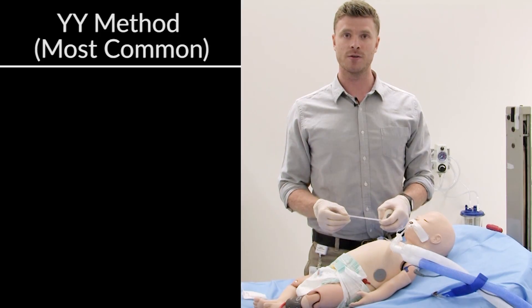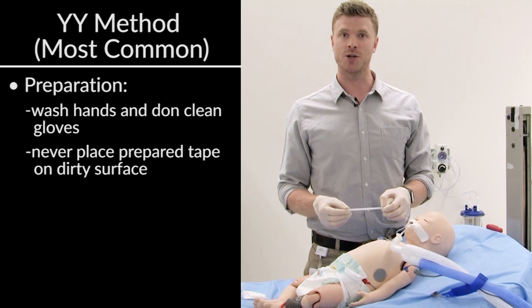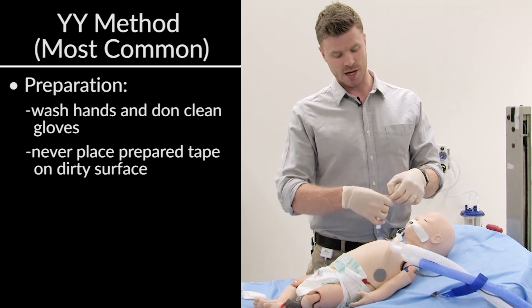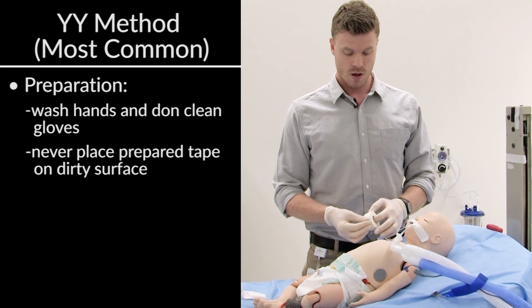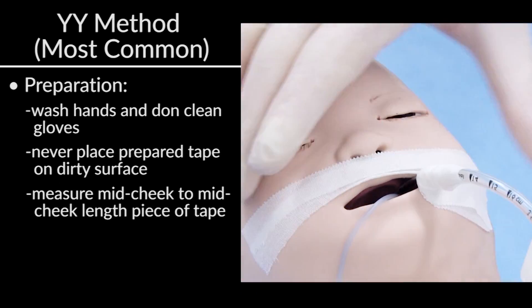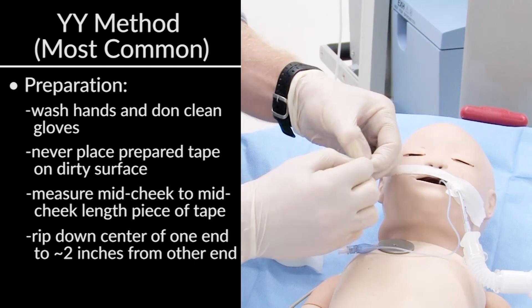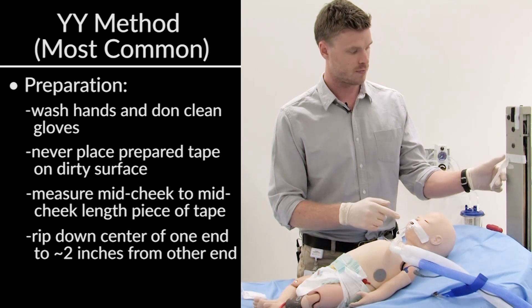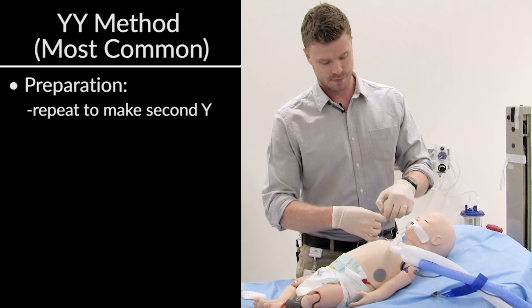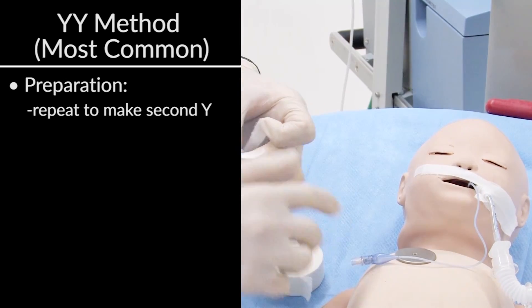I'm going to review the first oral method, which we refer to as the YY tape job. Always make sure that you use standard precautions — that is hand washing and gloves — and never put the tape on the face on a dirty surface. I'm going to put one piece of tape on the surface and stick my prepared tape on it so it doesn't touch a dirty surface before it touches the patient. You're going to want to measure out a piece of tape approximately mid-cheek to mid-cheek in length. I'm going to make one slice down the middle of the tape to about two inches from the side — this makes our first Y. Then do the same thing and prepare a second Y.